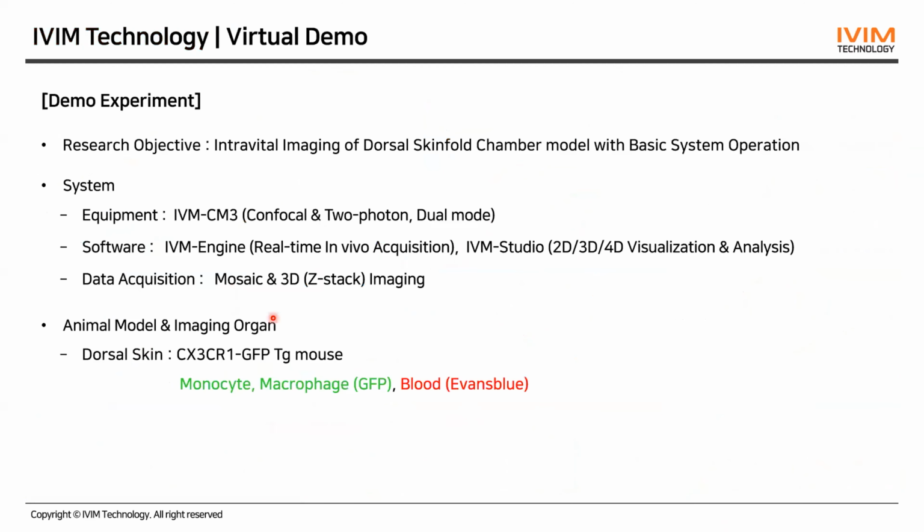Next, we are gonna quickly jump into the virtual demo session. Today, we will perform an in vivo dorsal skinfold chamber mouse model with the basic system operation. We're gonna use both the confocal and two-photon dual mode microscopy system, which is the IVIM CM3.